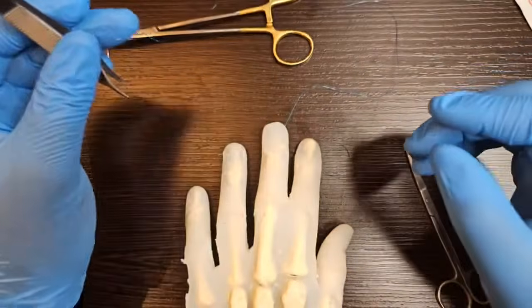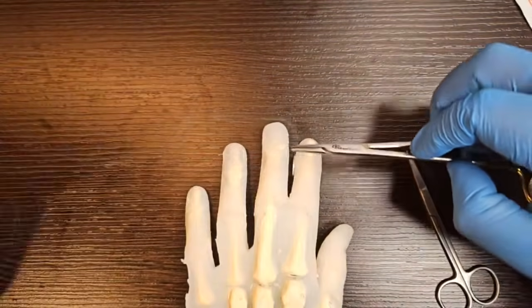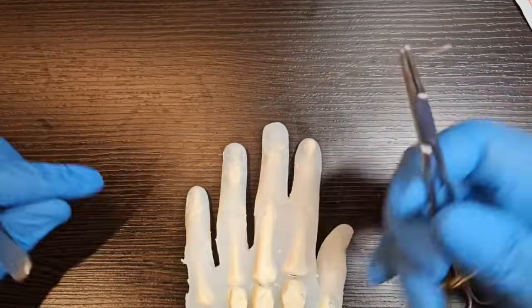For the purposes of teaching, I am going to use a dyed suture so that you can see it in the tutorial.